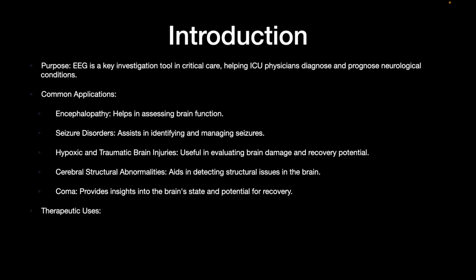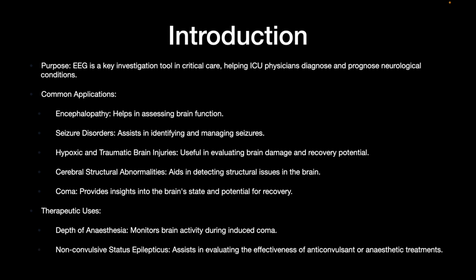potential for recovery. It has therapeutic usage like in monitoring the depth of anesthesia, and non-convulsive seizures, to help us in identifying the condition and using effective anticonvulsant therapies for its management.